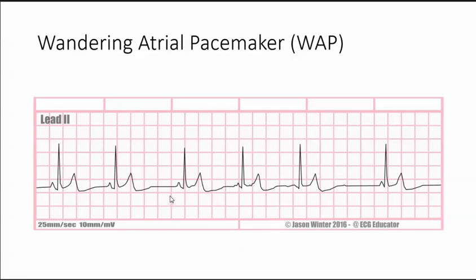Let's look here. Look at this P wave, and this one, and this one — do you see how they're all different? There is a P wave before each QRS, but they're all different. To call it a wandering atrial pacemaker, you need to have at least three different P waves.